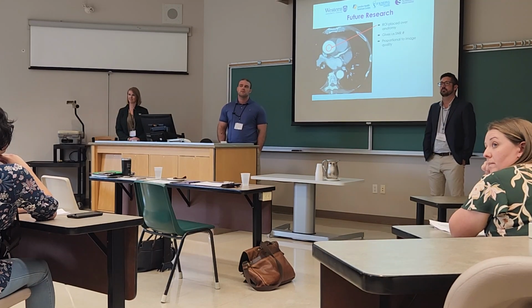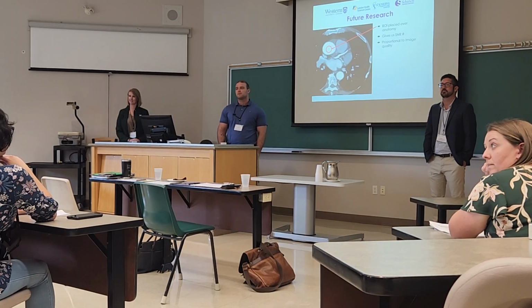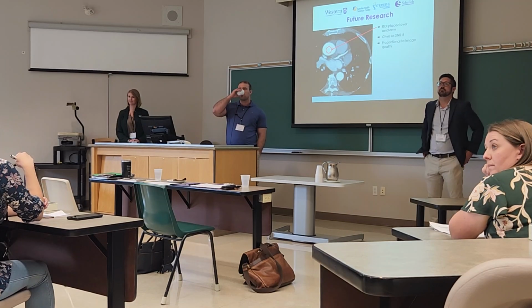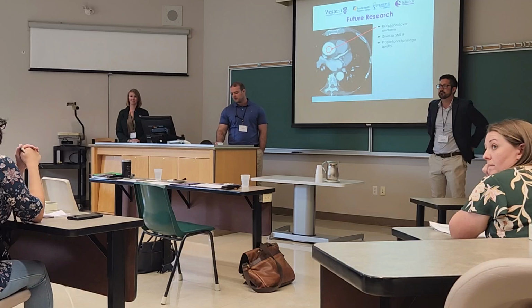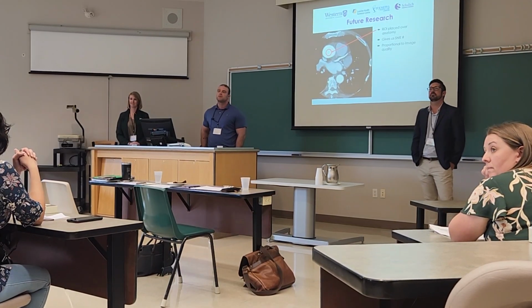Everybody's familiar with their smartphones and the computational photography that's going on, and your iPhone takes these amazing shots with these tiny little apertures. Same idea, it's happening on the medical imaging side. For CT, that's what's happening. So it's a deep learning reconstruction. It's letting us take undersampled data and really bring out a lot of the information that's there.